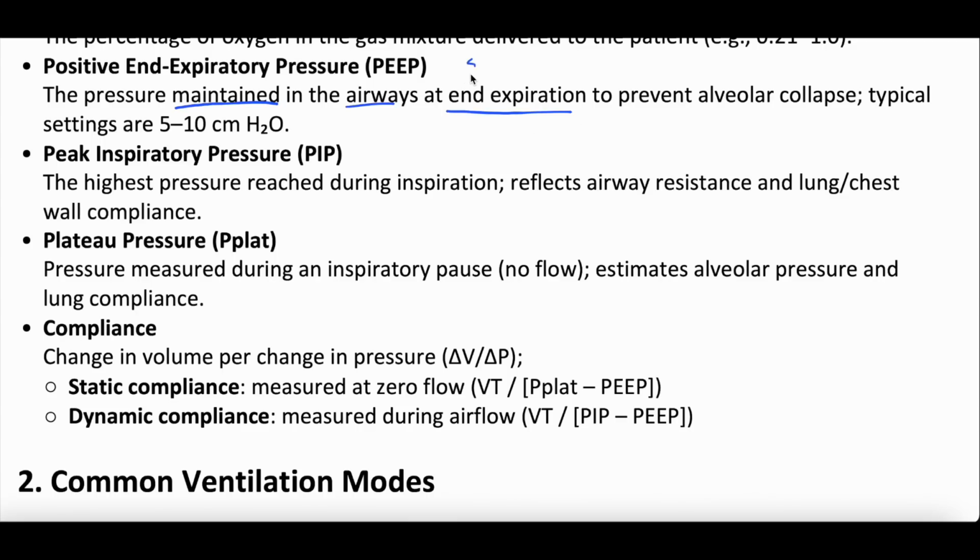And we set this. The quote unquote lowest PEEP that people use is 5, but you can set a PEEP of what you like. And the goal here is that it prevents alveolar collapse. Because if the PEEP went to 0, if there was no pressure and you let a patient fully exhale all of the air out of their lungs, those alveoli would collapse. And then when you push a breath back in, those alveoli will be kind of ripped back open, and it can lead to something called atelectatrauma. Atelectasis being that collapse of the lungs, atelectatrauma being what can happen if you have too much alveolar collapse and reinflation, collapse, reinflation, collapse, reinflation.